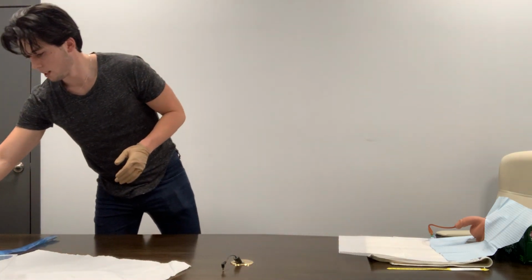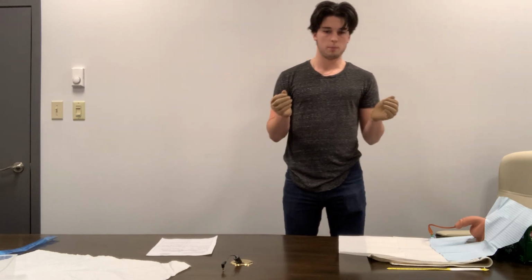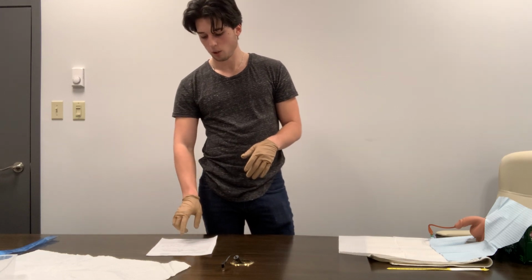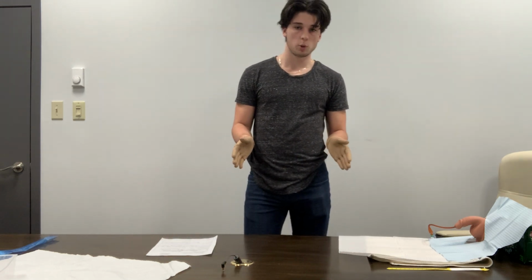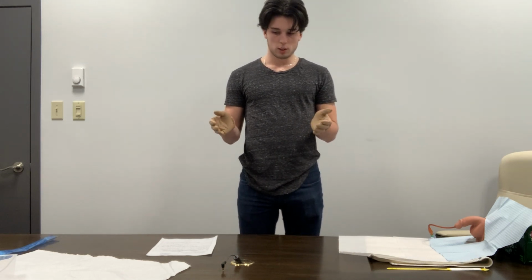So now on a different day, you would receive your new orders. You would come look at your physician's orders, and you would see that you have now an order for today to take out the Foley catheter now, as the intakes and outputs do not need to be monitored closely anymore for this patient. So again, in this case, you would go grab your supplies.